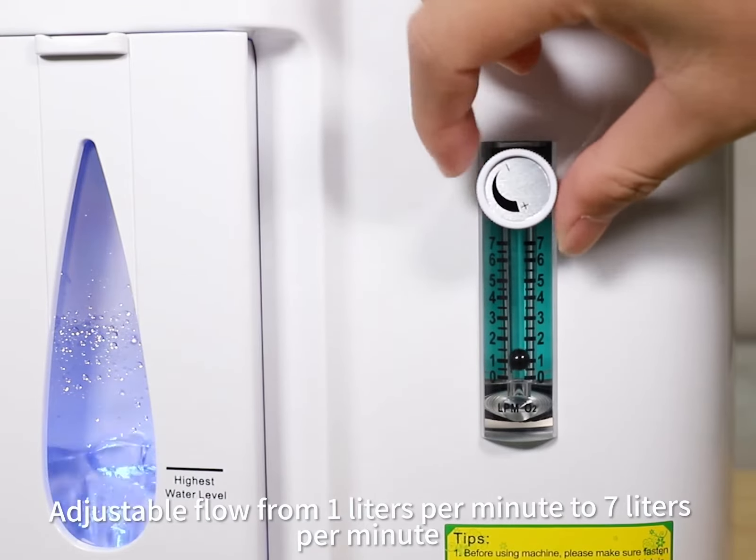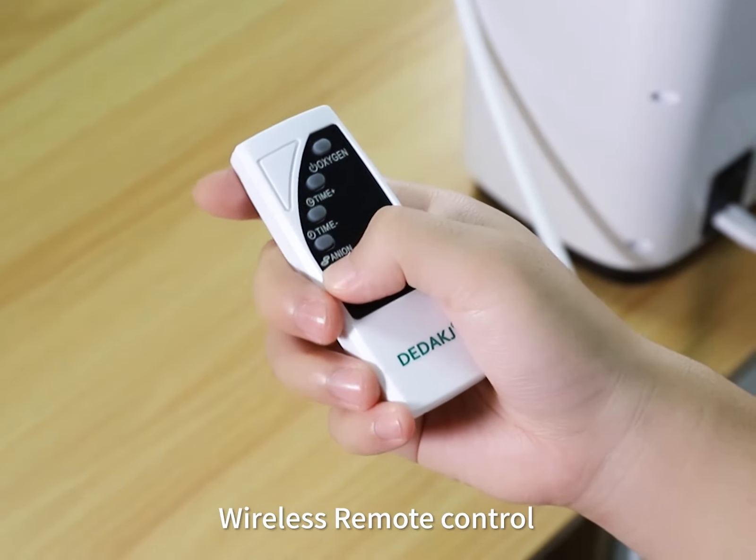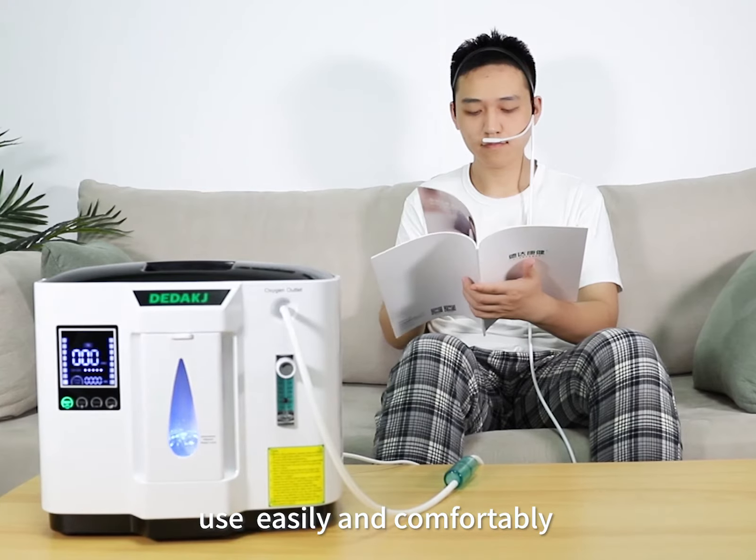Adjustable flow from one liter per minute to seven liters per minute. Wireless remote control — use easily and comfortably.